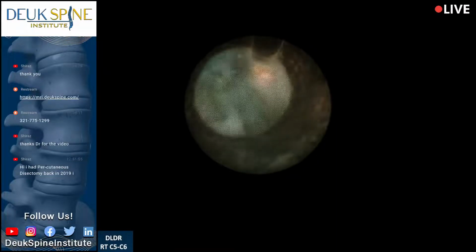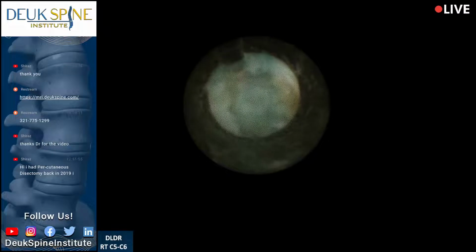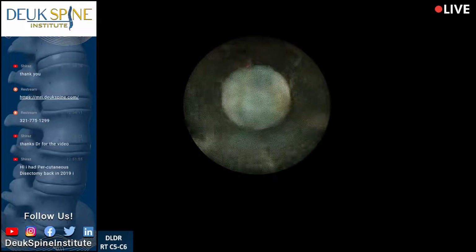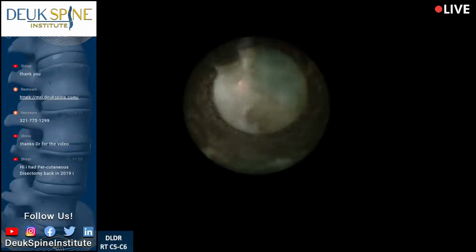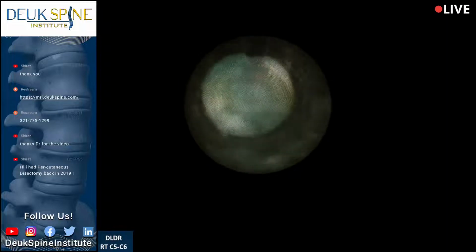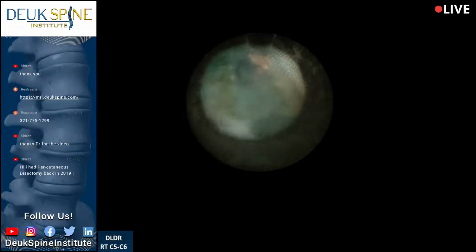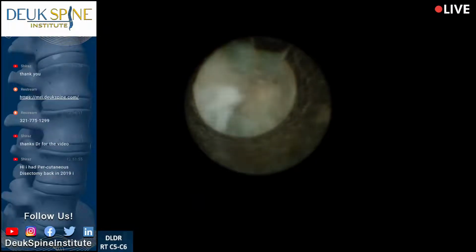This is the annular tear right here where the laser is working off to the right. We may be, oh, there's another herniation right there. Lots of pieces of herniation. And again, I'm just coming out and floating them out. They actually come out of the tube and float out onto the field. I think we went one click too dark. I would like to get just a little bit of light back. That's perfect. Thank you.